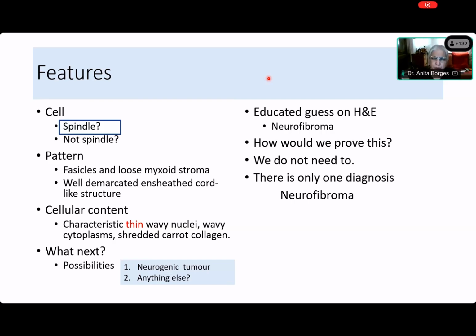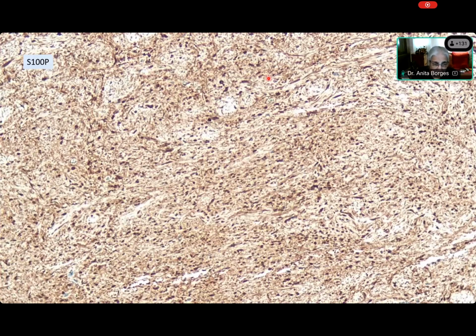Absolutely, and you've got the myxoid stroma and the wavy bundles and the shredded collagen. You don't need any other evidence that this is a neurofibroma. All right, and if anybody wants to know whether this is S100 protein positive, it is, and it is also expressing SOX10 in the nuclei. It is not to be done. This is only for demonstration. If I have a student and the student does this, they would be shocked.